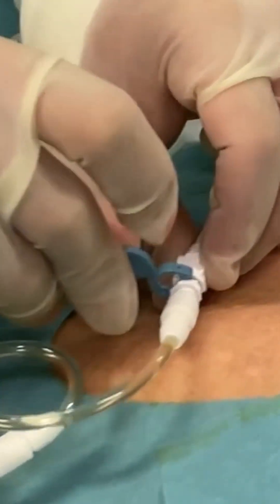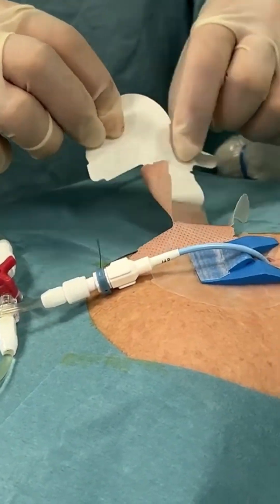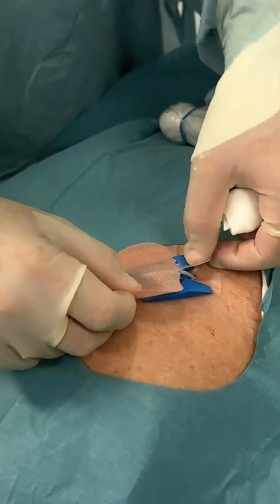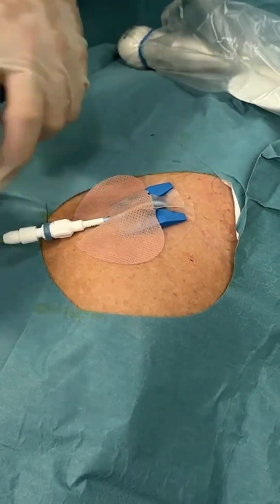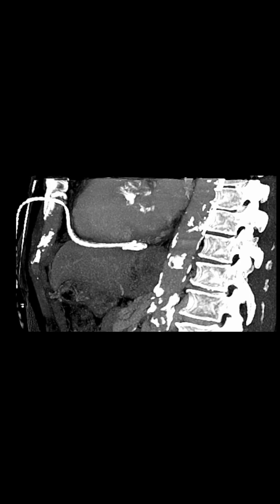When all of the fluid has been removed, leave at least 15 centimetres of the pigtail inside the patient. Then lock the pigtail using the wire. Make sure the catheter is secured and use gauze to prevent any pressure on the skin. Note the perfect location — far caudal and dorsal. And the fluid is gone.